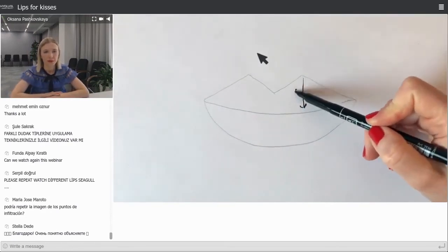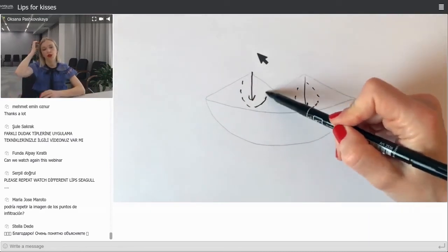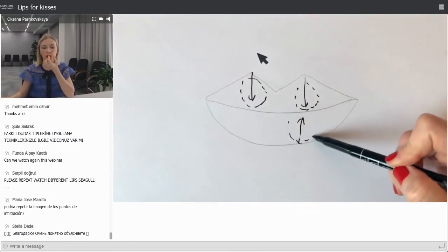Thank you, Stella. That's what I mentioned before about boluses. Just pinch your lip where the tuberculum, the lateral tubercula, are situated, and go through the skin or definitely through the red lip, and just put an additional volume like boluses.